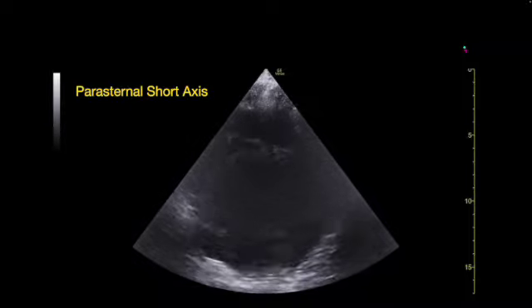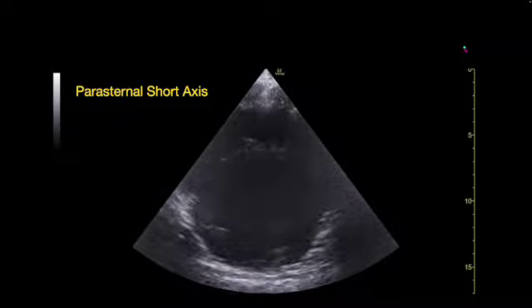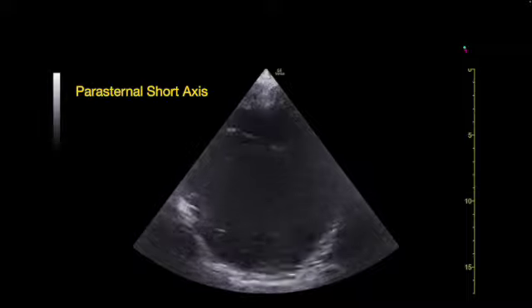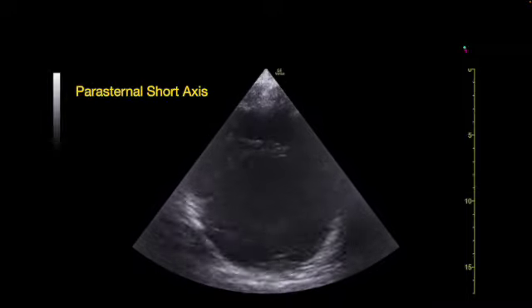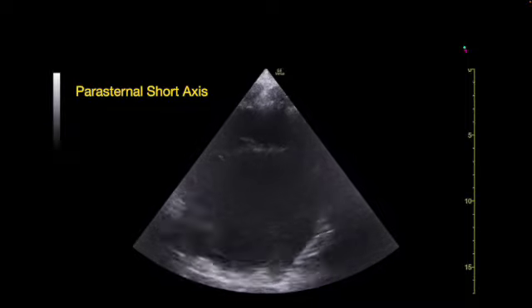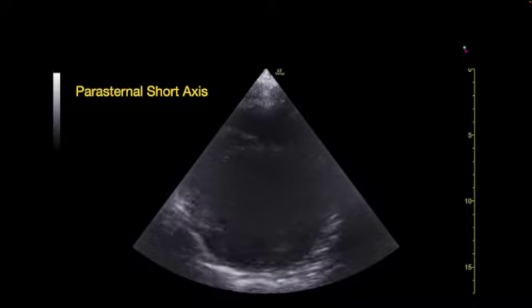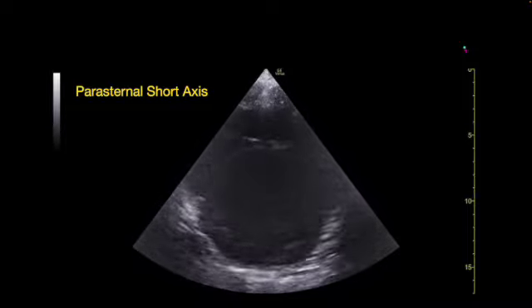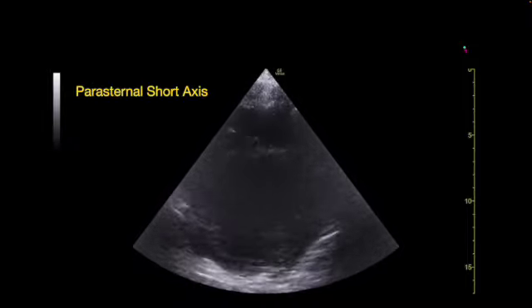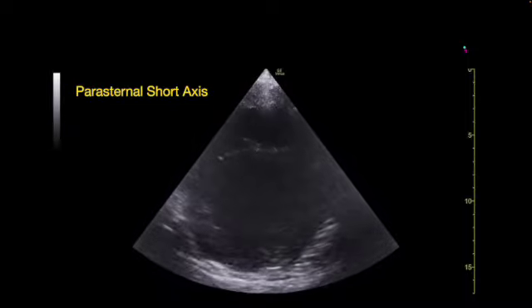evaluation, which I encourage you to do when you're first starting out, eventually, when you look at so many, you'll be able to gather the information that you need at the bedside with these suboptimal views, the more you look. So I encourage you to look at normals and abnormals, even if you don't feel qualified, or if you're not able to bill for them or integrate them into medical decision making on your own yet. I would still encourage you to practice and get as many images under your belt as possible.